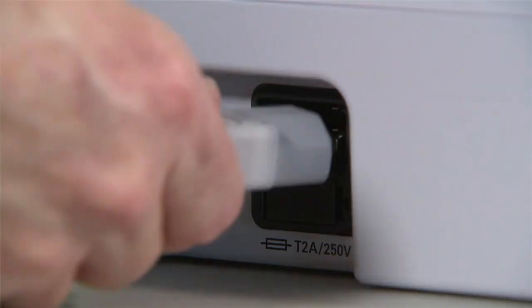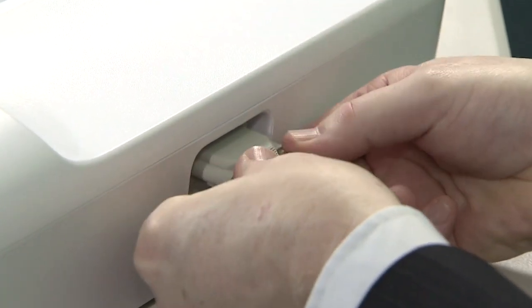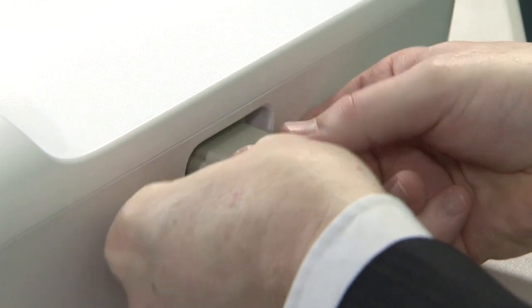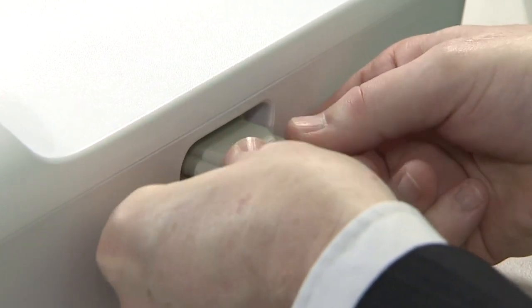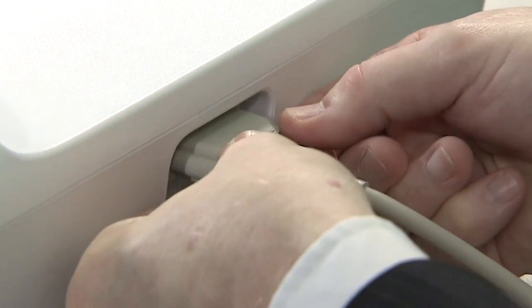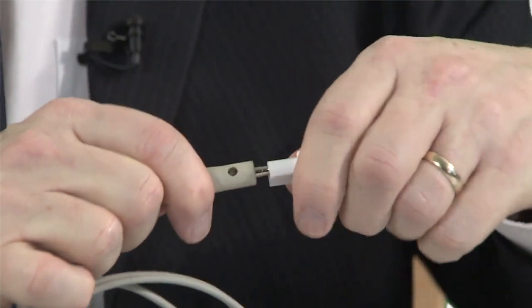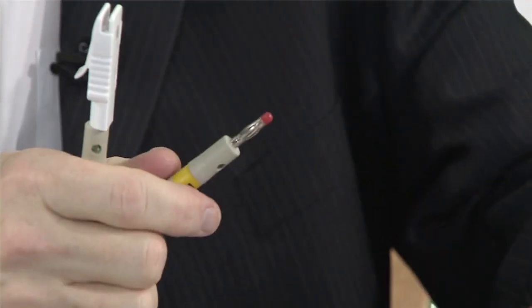Assembling the components of the unit is really simple, beginning with the mains cable. The patient cable goes into the port at the front of the CP150 — push it in to the port and tighten the screws either side. Once the patient cable is in you can then fit the crocodile clips to your patient cable, one for each end.